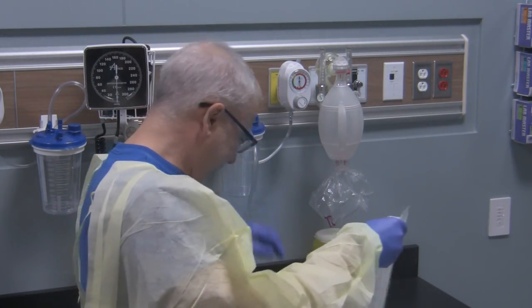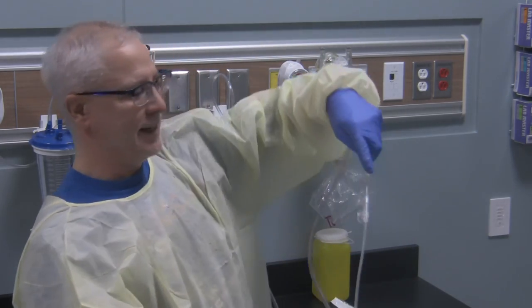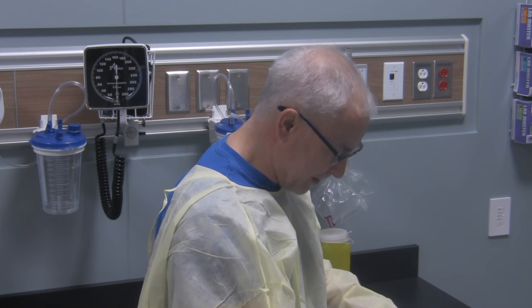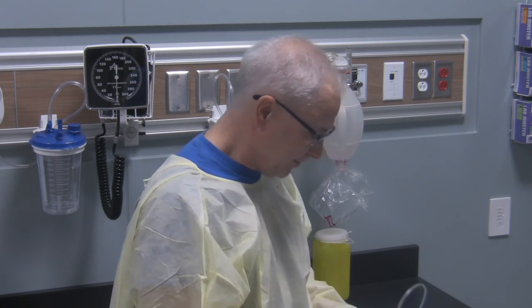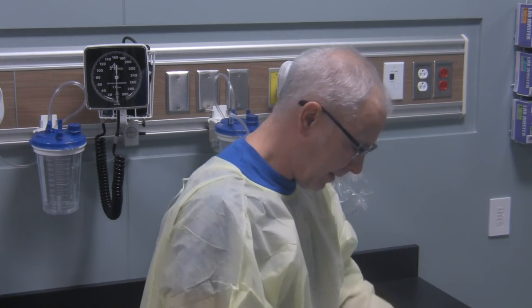I got a little bit out but not a lot to show you. Anyway, when you're done suctioning the patient you can see there's some secretion in the suction tubing. What I'm going to do is simply clean that out — you want to leave your suction tubing nice and clean.